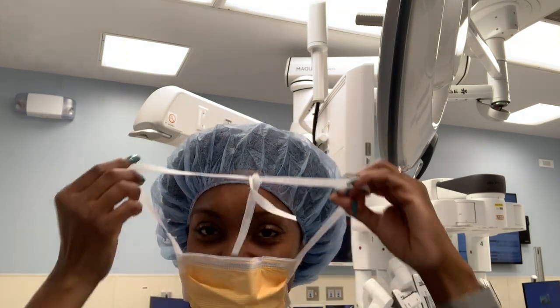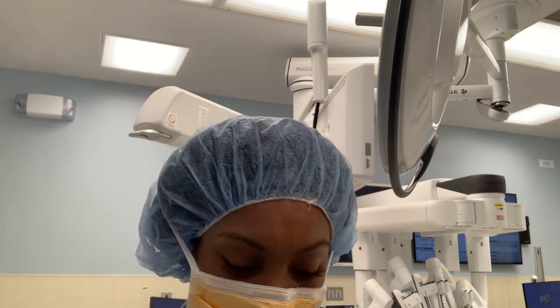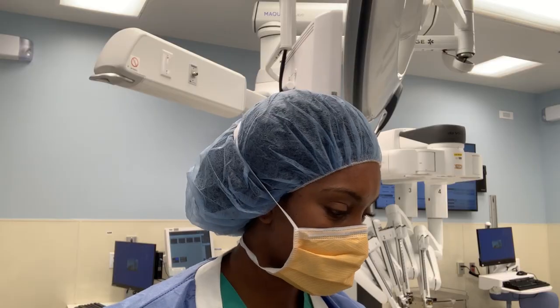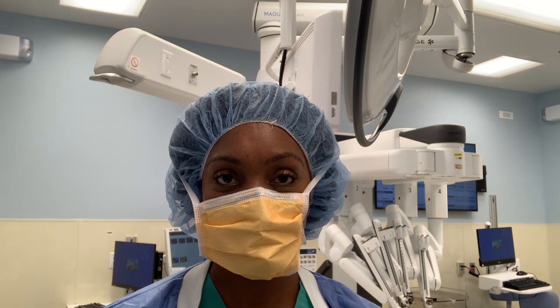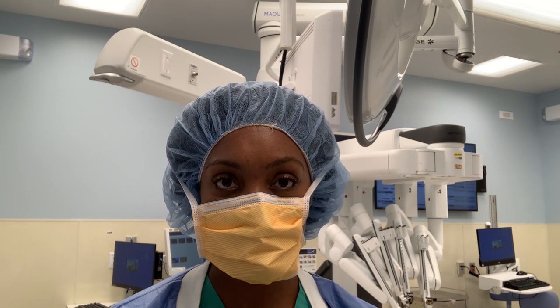So with the Da Vinci in the background, I'm gonna start setting up for my case. There's really no need to put on your mask before you set up for your case, but I just feel like it adds a little bit of effect. I'm gonna do it. First things first, you want to check to make sure you have everything you need for your surgery, and that is everything you need for safe delivery of anesthesia for your surgery.